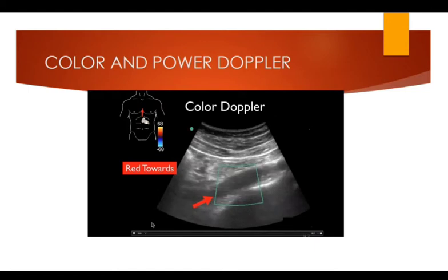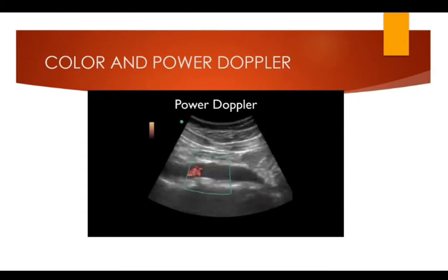And so now the aorta is coming out this way and it's coming towards us. And so now we see that in correlation to where the probe's placed, this is coming at an angle towards it. And so this gives us a red color within the vessel. And like I said, this is the exact same aorta. Remember, vessels do not light up one color or the other. It depends on what direction the blood flow is coming to or away from the probe. So before we saw it in blue, now we're seeing it in red.